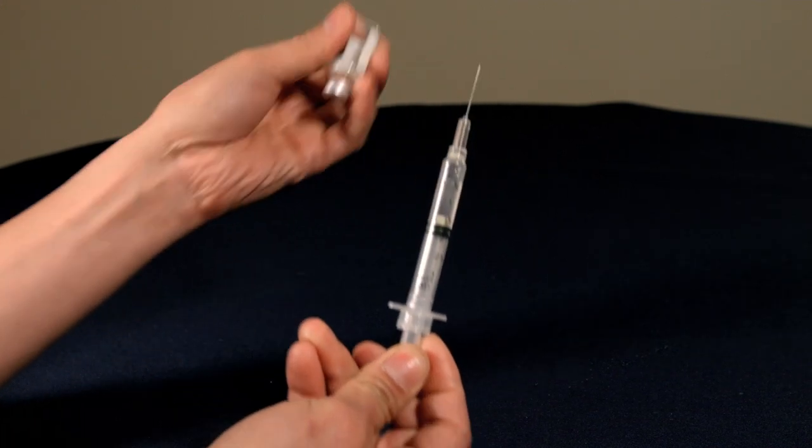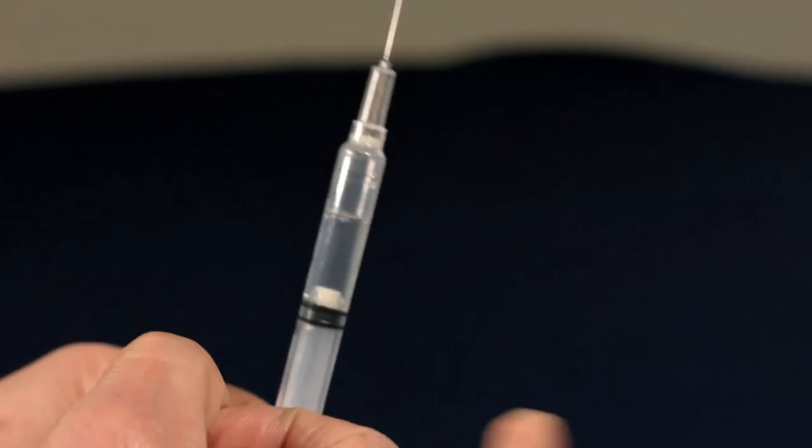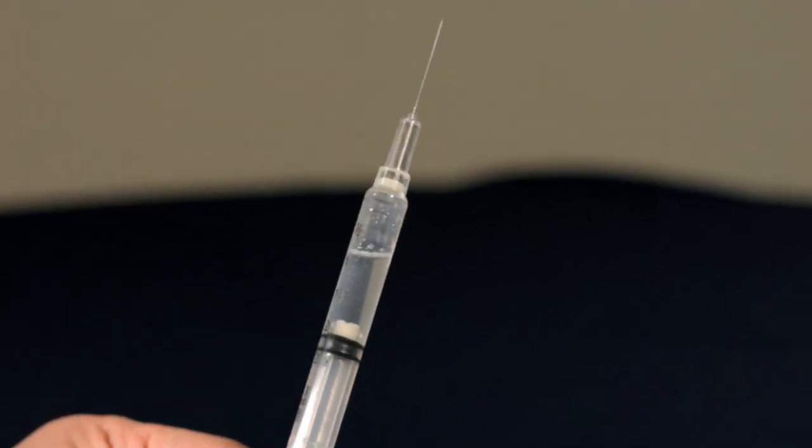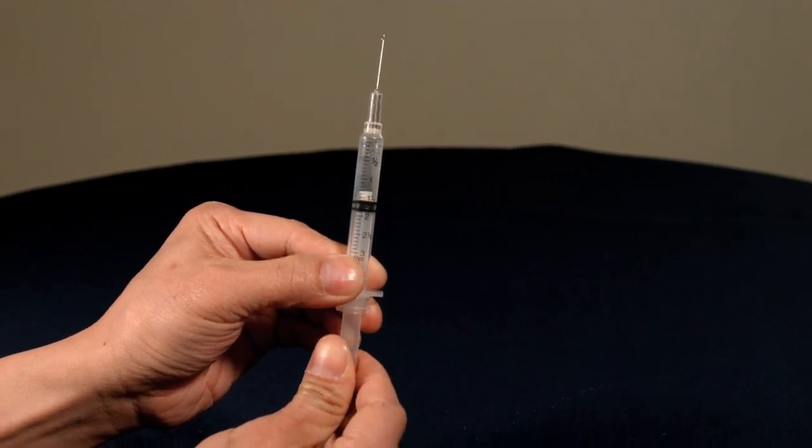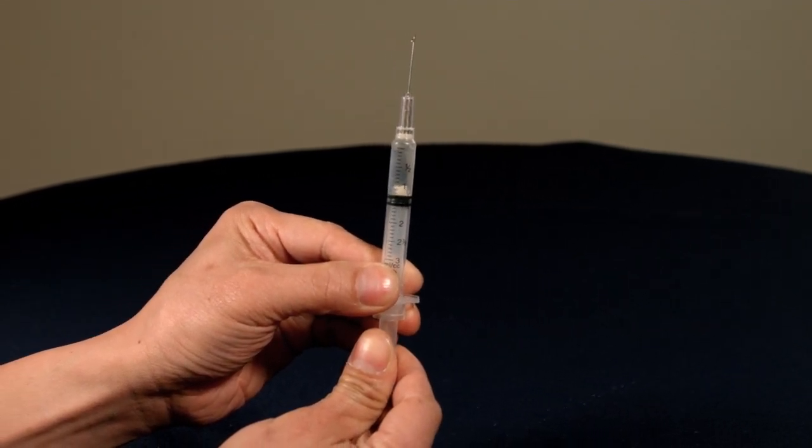Hold up the syringe at eye level and tap the side to loosen any air bubbles. Remove any air by squeezing the plunger until a drop of liquid appears at the tip of the needle.